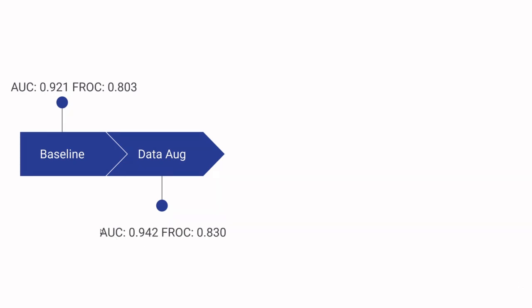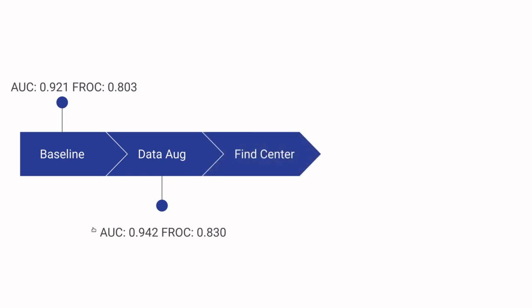Then I looked into our annotation challenge again. At the moment, we just take the label, create the bounding box, and use it as it is for our object detection framework.